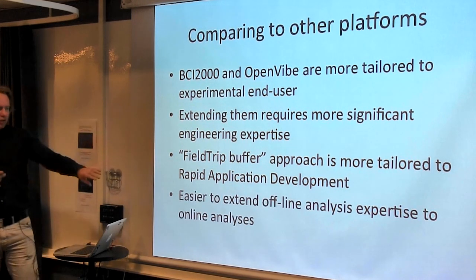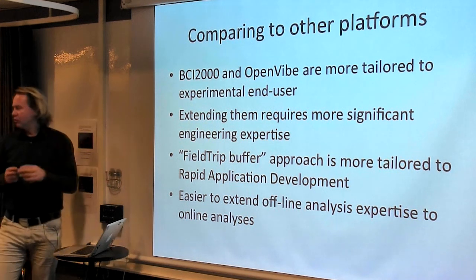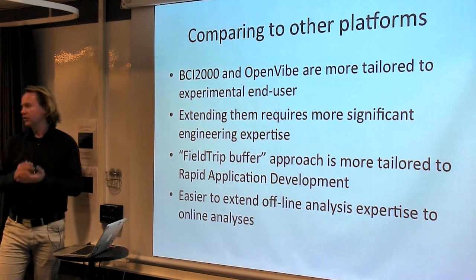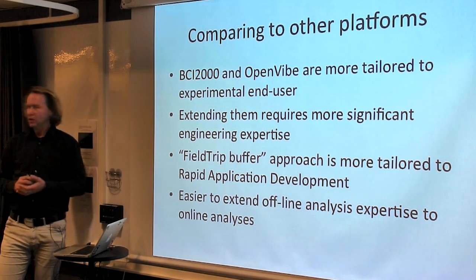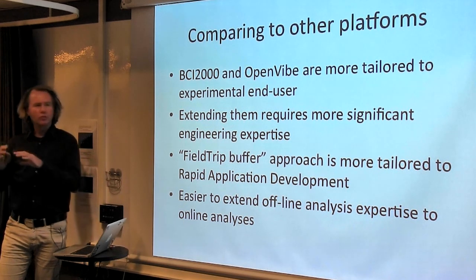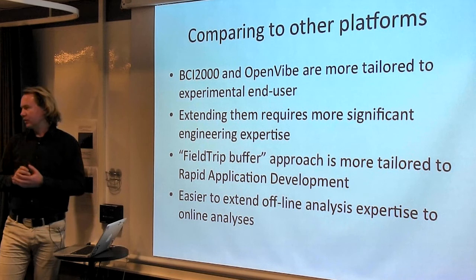And I think it's easier to extend your expertise that you have or that you're currently building up in terms of offline analysis to the online analysis case, because it uses the existing MATLAB interface, so you can use a lot of filter functions in your real-time experiments.